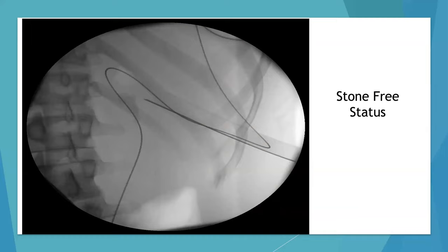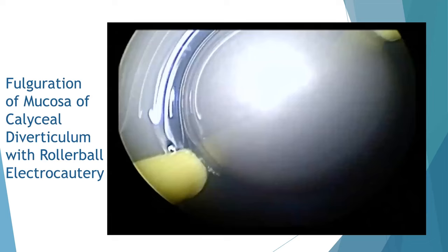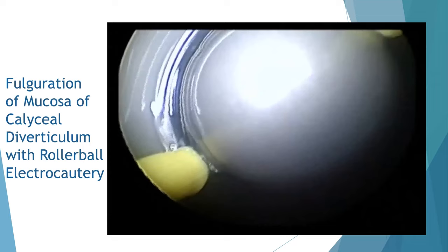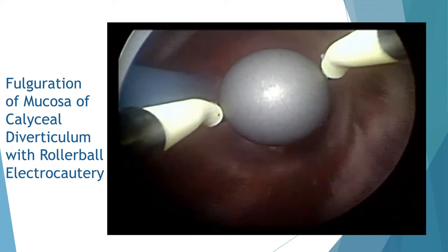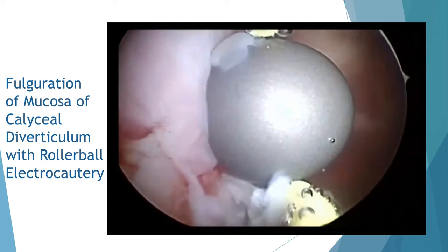The cavity is demonstrated to be stone-free after extraction of the stones. At this time, we proceed to fulguration of the mucosal lining of the caliceal diverticulum. A transurethral resectoscope with roller ball electrocautery was used to completely ablate the lining once stones have been removed.